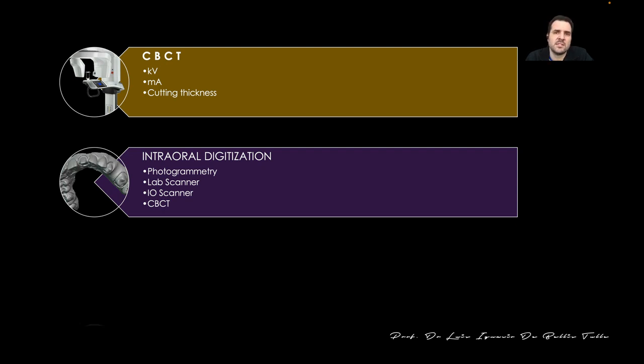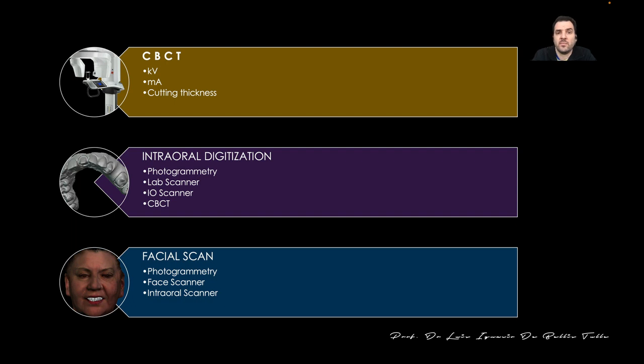And the last pillar, but not the less important, is facial scanning, that has been added to our workflows in a very nice way in the last few years.